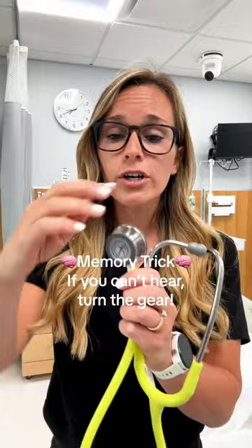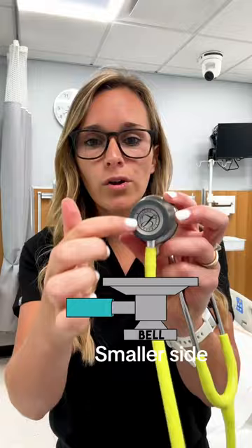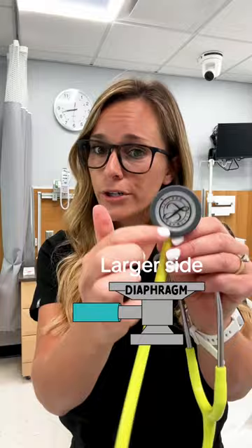Next is the difference between the diaphragm and the bell. The bell is the smallest circle, as you can see here, and this is used for low pitch sounds like heart murmurs. The bigger circle, or the diaphragm, is used for high pitch sounds like listening to heart sounds or lung sounds.